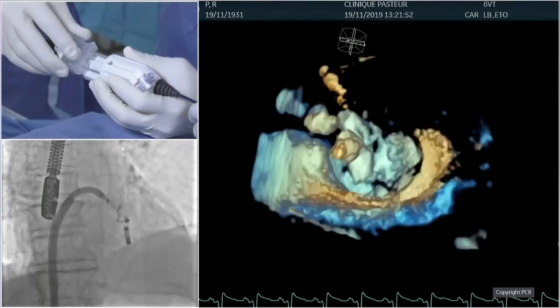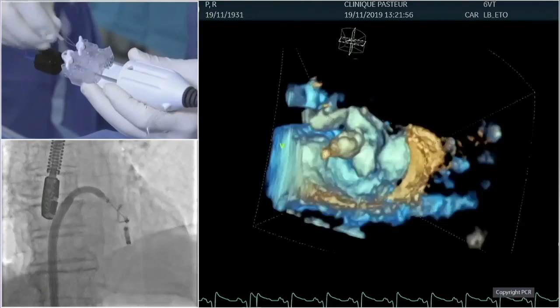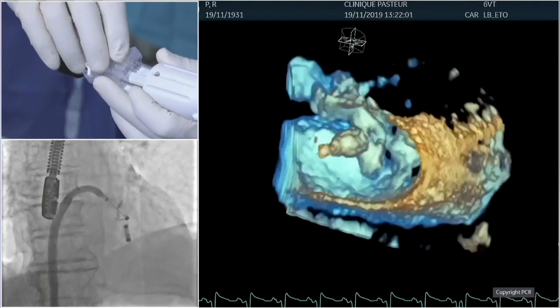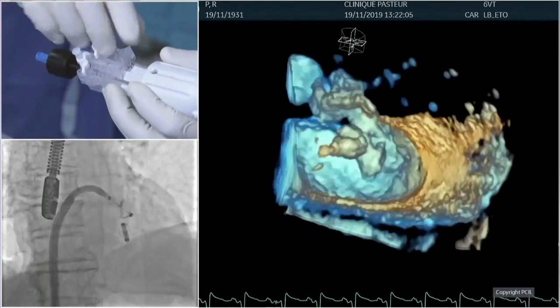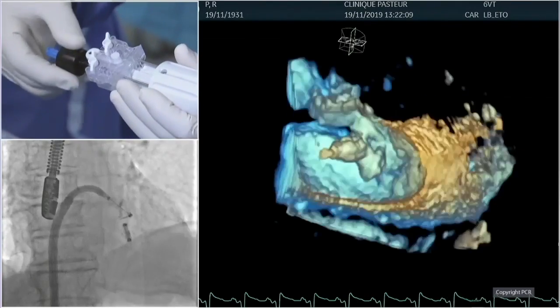Okay, so you see the clasp testing? Yeah. Okay, both are descending. I have to check now where is my anterior clasp control. So again, the same maneuver. Yeah, the anterior is anterior, it's okay. Anterior is anterior, it's the one. Okay. That's fine. So let's elongate it, Nico. Okay.